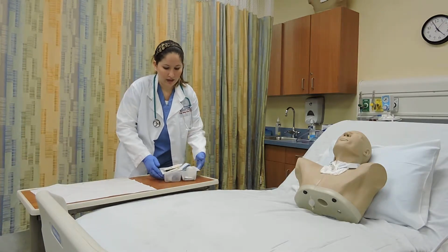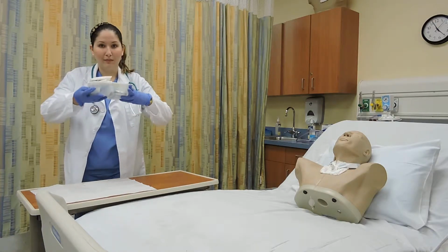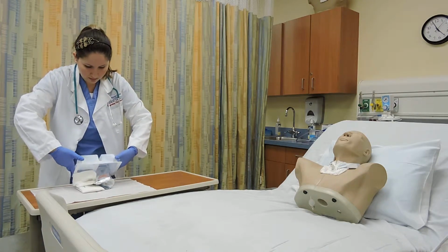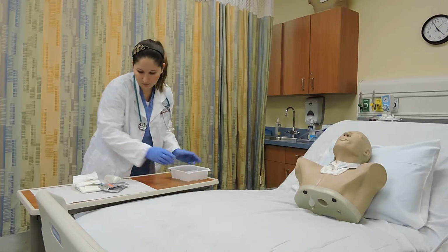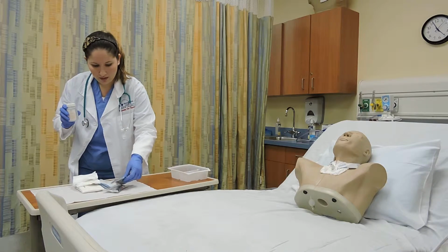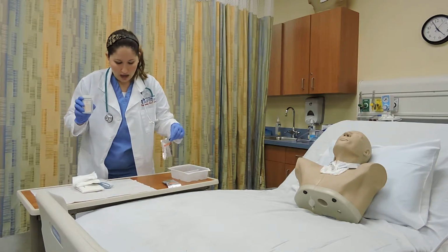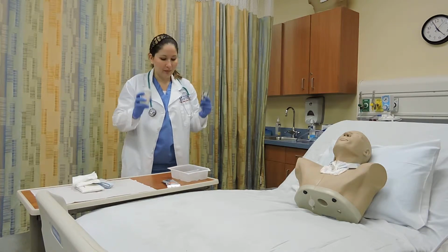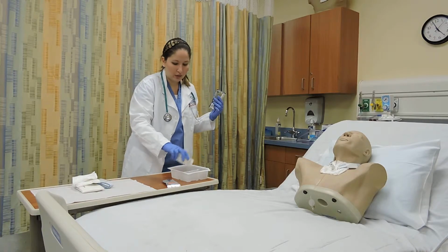Now I'm going to carefully dump everything that I have in my trach care kit onto my sterile field. Like so. Here we have sterile water, hydrogen peroxide, and some more hydrogen peroxide. I'm going to mix the sterile water and the hydrogen peroxide in this container, and then just sterile water in the other two.